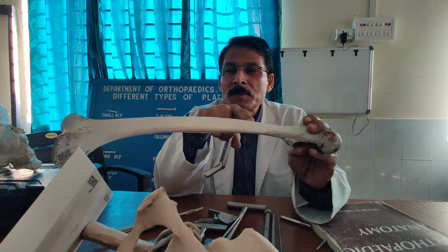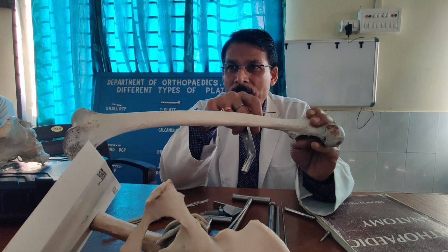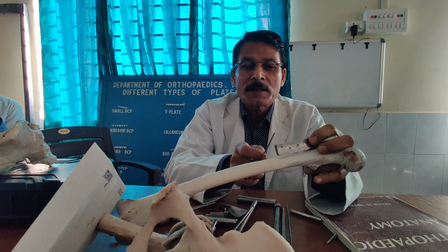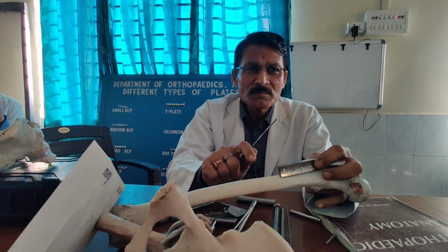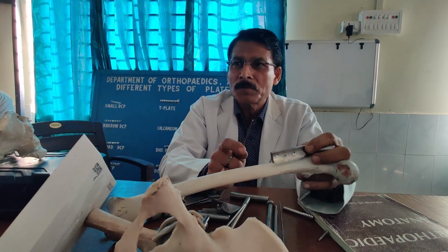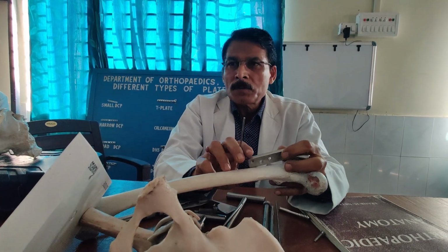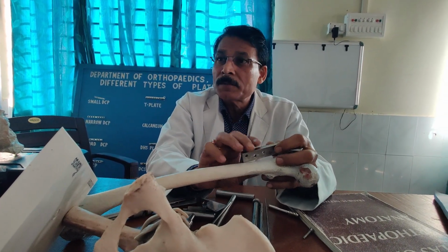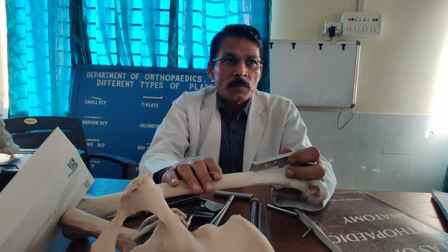Again, in earlier days they used to give one single cortex. This concept is no more applicable nowadays. You must have seen the old cases, old DHS, where they used a single cortex. But this is not applicable nowadays. They are saying it is the same; you can give full bicortical fixation there. So that is why this screw should be started last, and you can maintain the plate so that it is not offset. It should be corrected. Okay, sir?